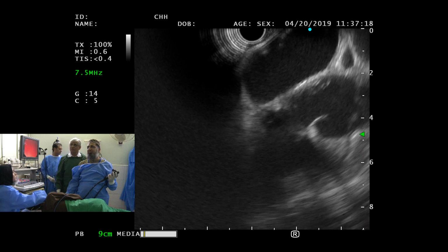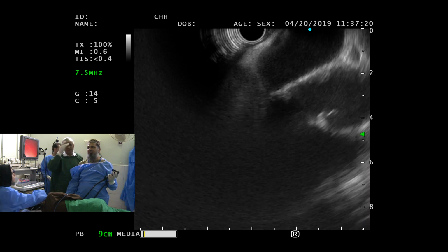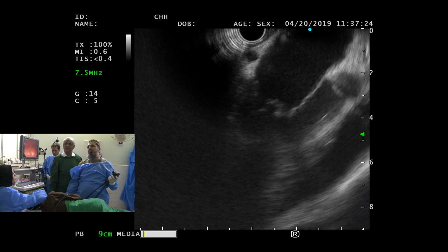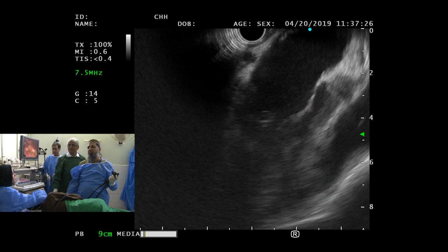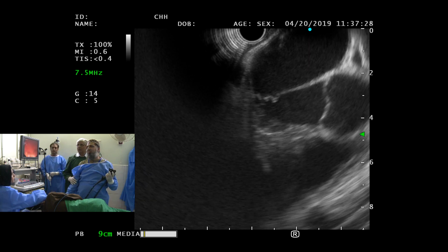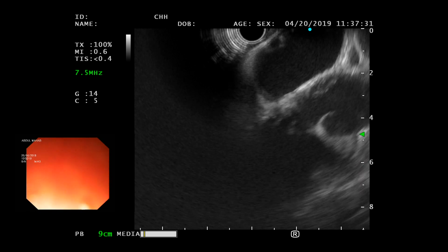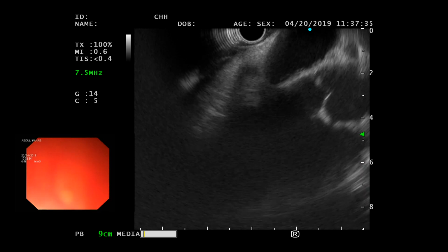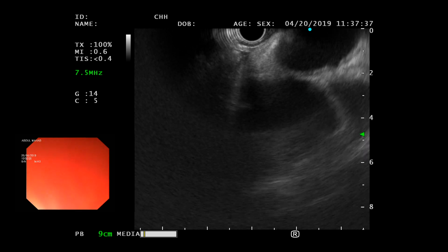This patient has chronic pancreatitis, and he's been referred to us because he's got severe pain, so he was referred for celiac block. While we were doing this, the next thing, and Dr. Saab will do it now, was to go to stations in the mediastinum, so look at the subcarina, and so we will just show the subcarina now. Pull back a little bit.